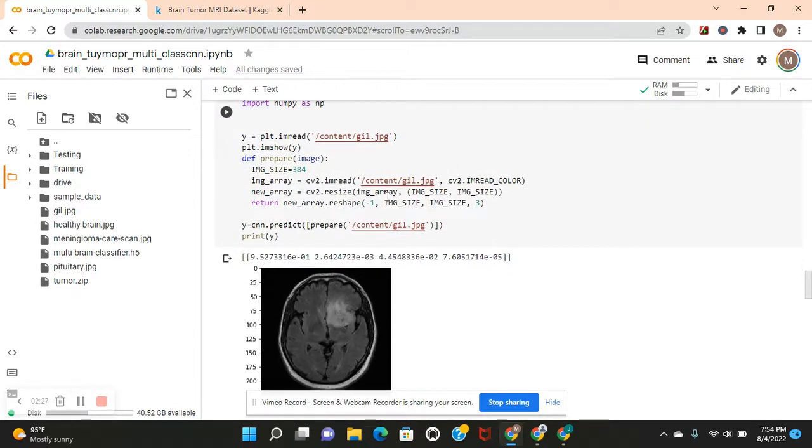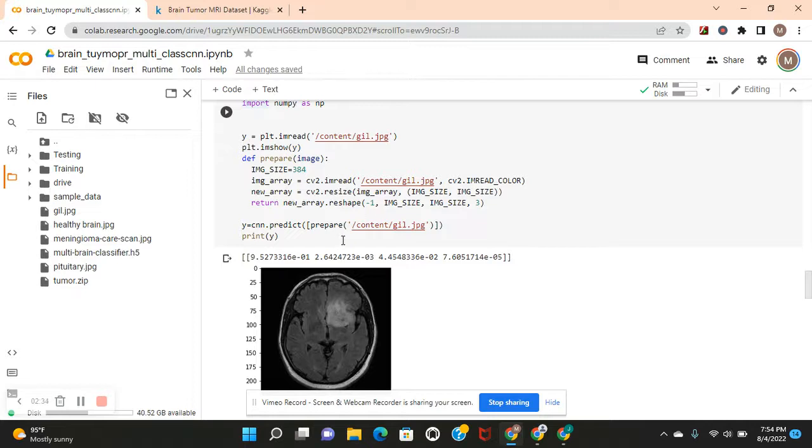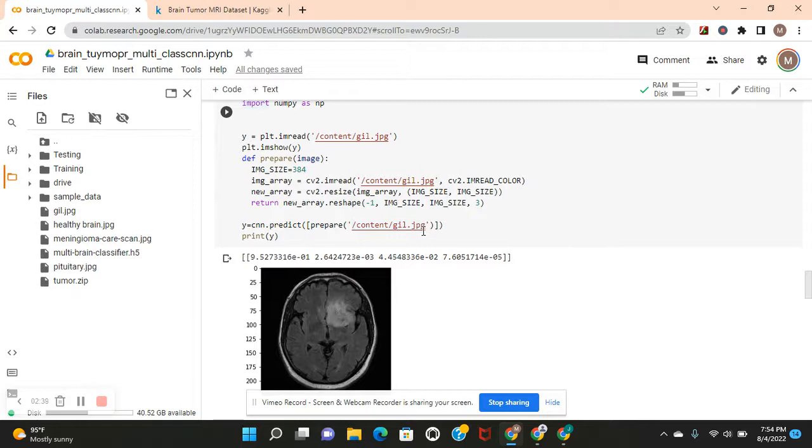CV2 IM color. Resize the arrays. Reshape negative one and three after the image size. Return it. Predict prepare. And here we go. It predicted the image.